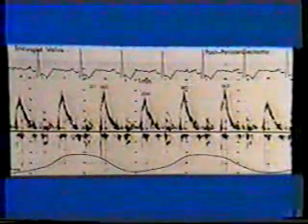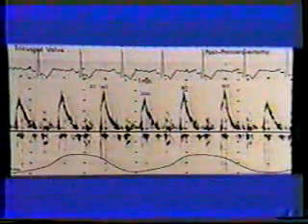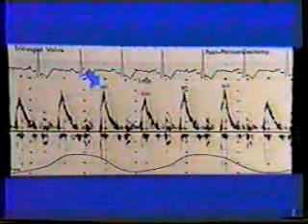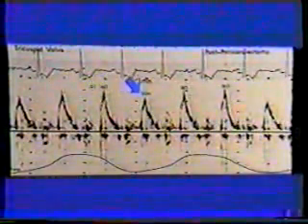Post-pericardiectomy, there is very little variation in tricuspid time velocity integral from inspiration to expiration. In addition, the variation in deceleration time throughout the respiratory cycle is blunted.